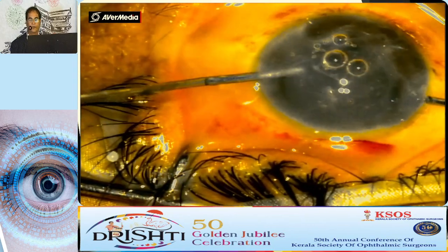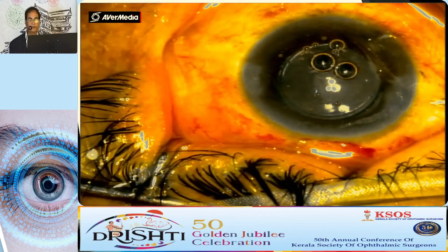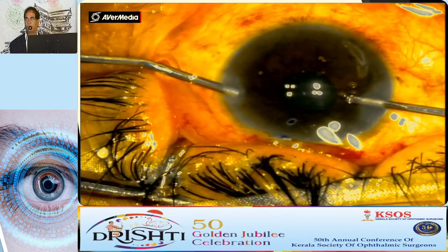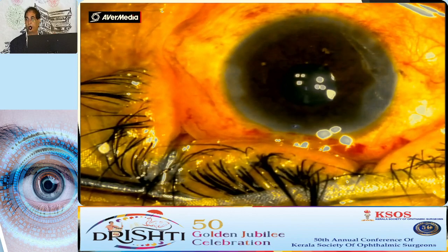Now I am using triamcinolone in this, to check whether any vitreous strand is there in this section. And at the end, you can use pilocarpine. If you have a doubt, you can use a spatula and swipe over in the iris plane.